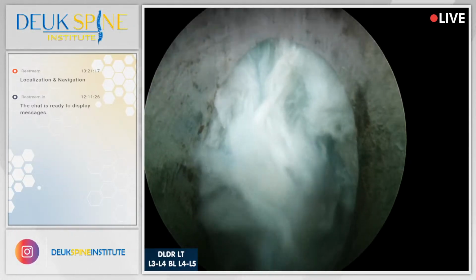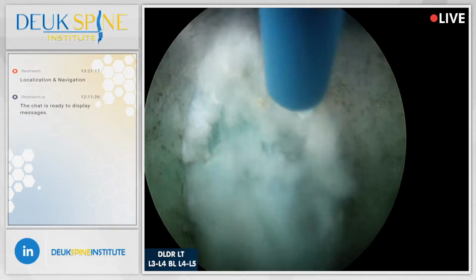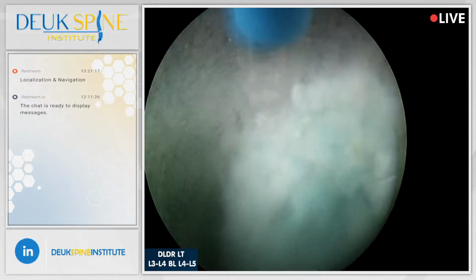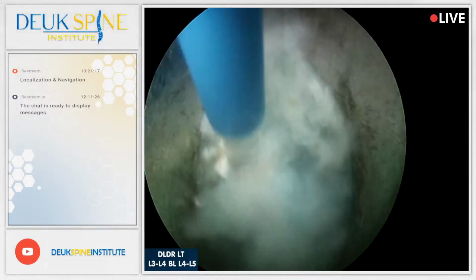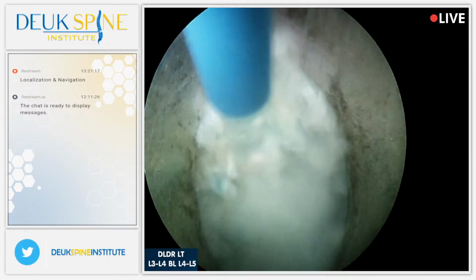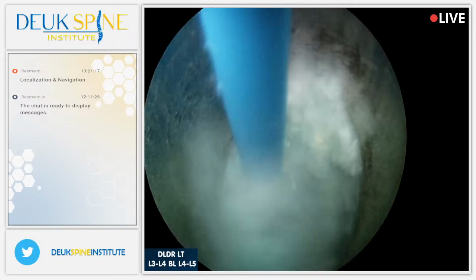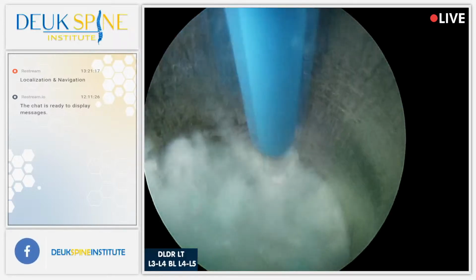So we're working between those bones. And this is where the disc is, between the surfaces of the bone, between the end plates specifically. End plates, E-N-D-P-L-A-T-E-S, for those of you interested. The disc is a soft structure located between the vertebral body end plates. We're not messing with the bones, we're just fixing the disc.